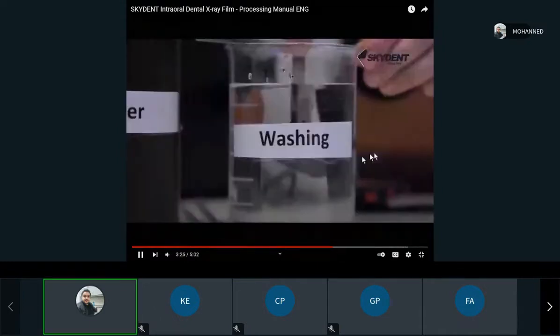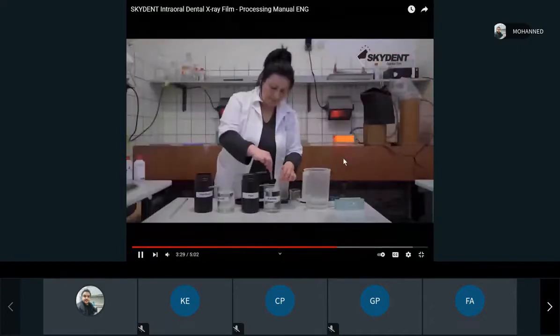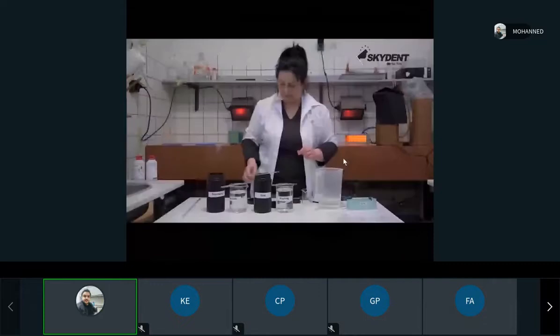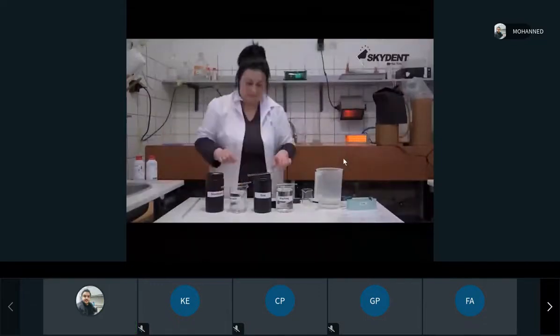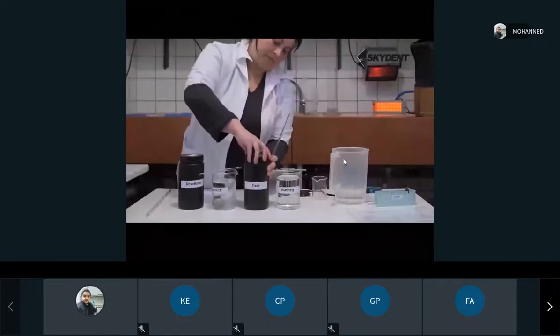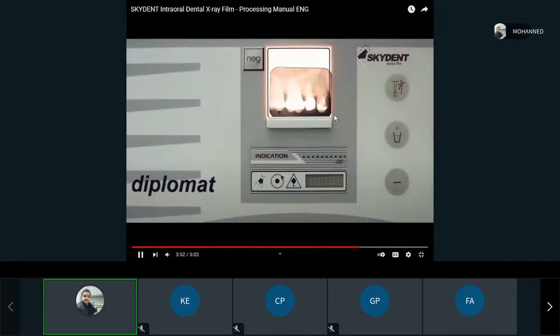After using the solutions, rinse the picture carefully with water. Let the image dry carefully. Change the washing water according to the need and degree of pollution. Close the solution containers carefully. After drying, pass the picture to the doctor for further diagnostics. Boom, and we get an x-ray.